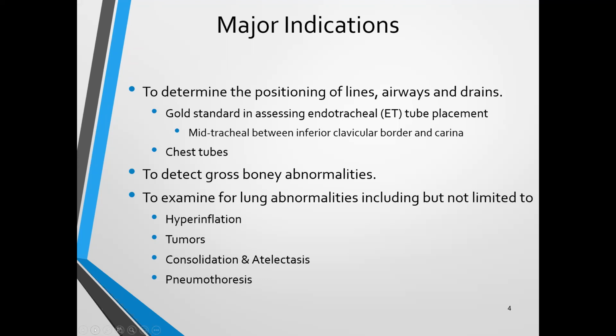It may be secondary to even things like a mucus plug. So you have a mucus plug or two or three, and then any of the airways distal or downstream from where those mucus plugs are can become, and often do become, atelectatic.